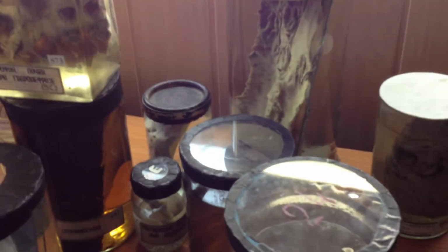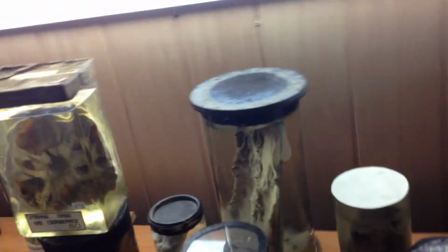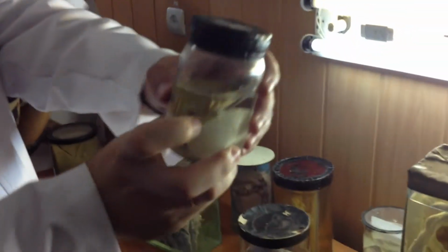Teacher, what about this one? This is the intestine during typhoid fever. Okay. Something else we didn't ask. Again, the same, yes. Teacher, what is it, teacher? Appendicitis. Yes, phlegmonous appendicitis.